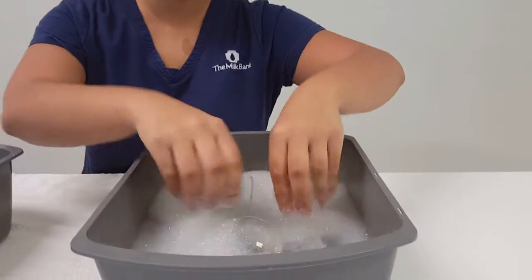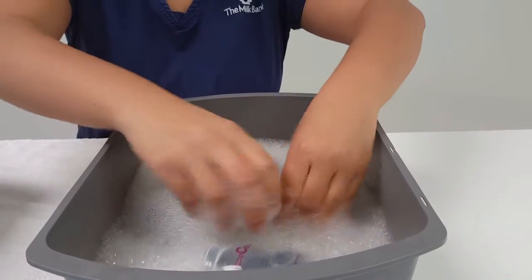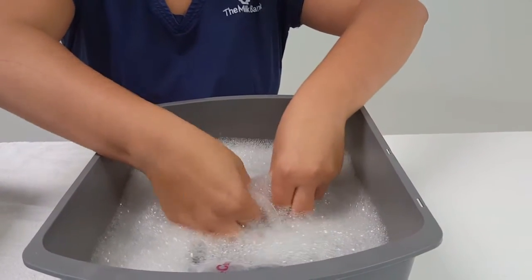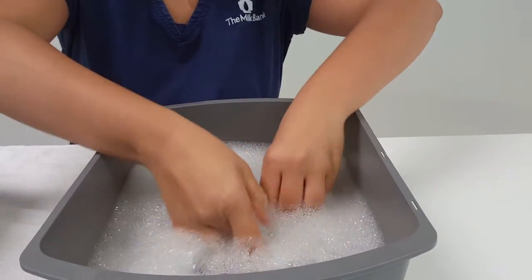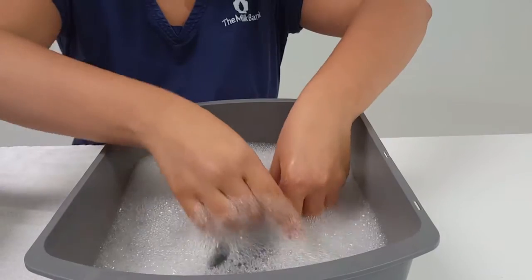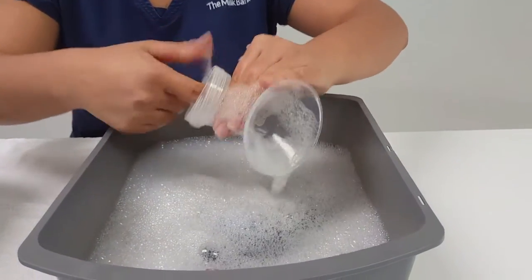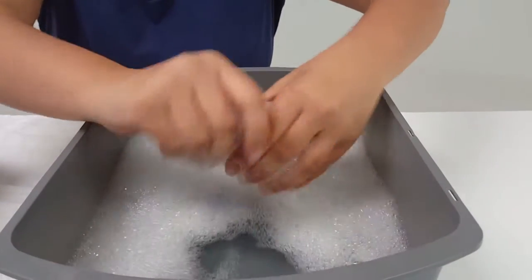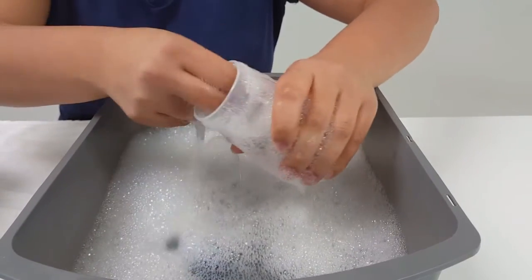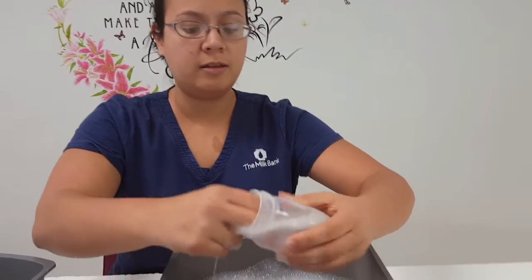So we're just going to put it into our bucket of hot water, and I just have hot water with a gentle soap. Typically Dawn is what I use, and I just let it soak in there and, just using my fingers, sometimes I use a brush when I'm at home, but when I'm at work I just use my fingers and make sure I get everything nice and soapy. Get them in there. Make sure we get the bottle really well too. I typically pour my milk into a bag when I'm done, so I always wash my bottle after I pump with it.